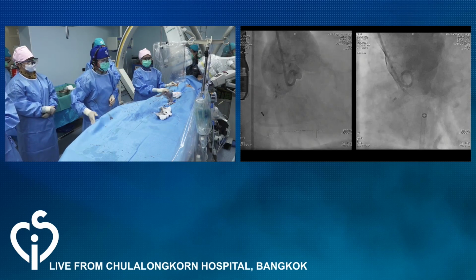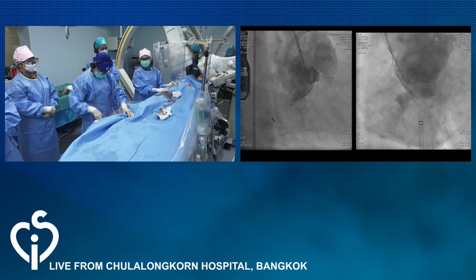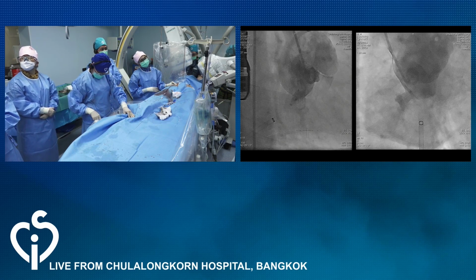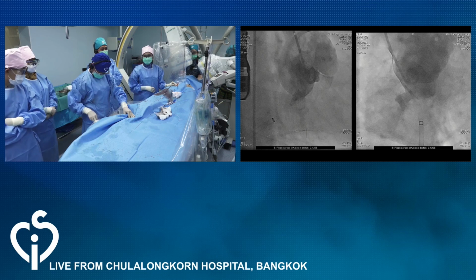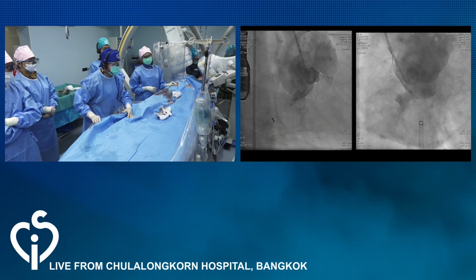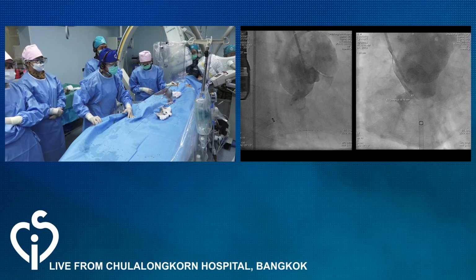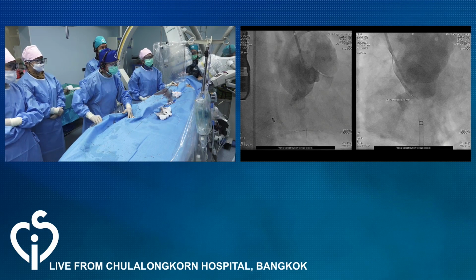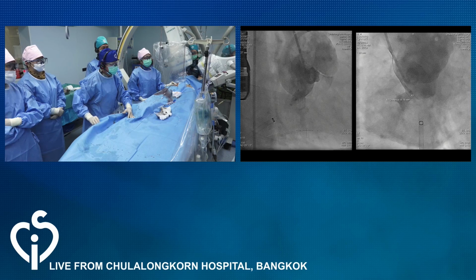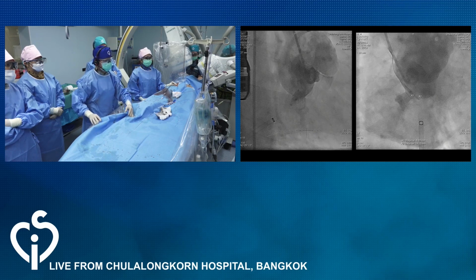In RSOV, many times we see tiny defects which we won't be able to see because of the color flow that covers them. If you go through the tiny one, because of the sheath and the constriction being quite significant, one of the post-procedure TEE at 45 degrees showed a superior defect which is jetting into the RA. So my question is whether we missed the bigger one, went through a smaller one, and closed it. That's not a bad waist there.